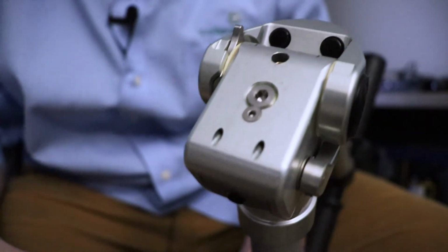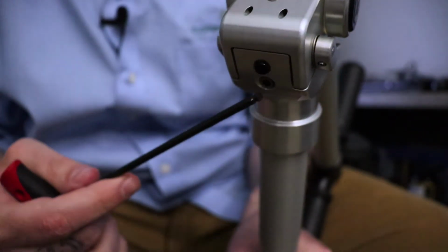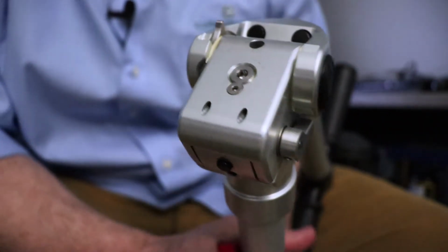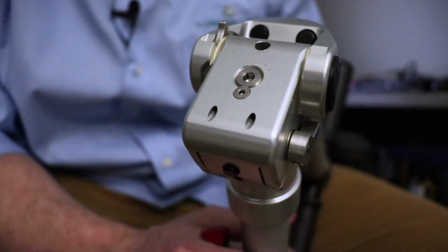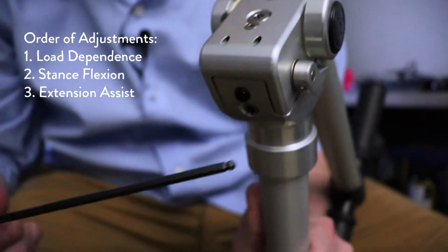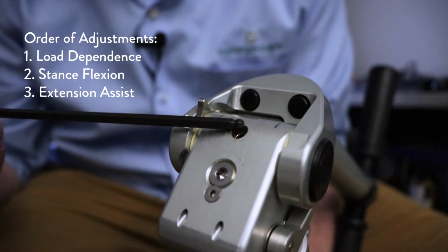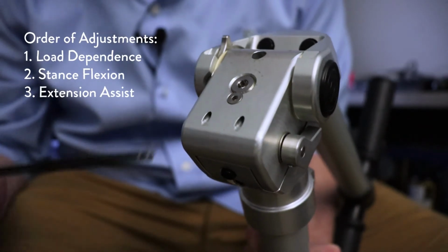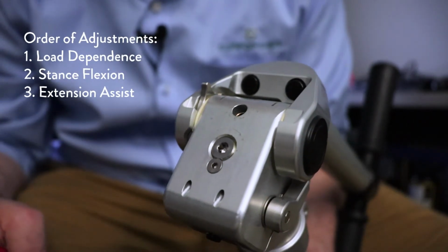Now if this still isn't sensitive enough, you need the brake more sensitive. That's when you move to the stance flexion and remove a little bit of that stance flexion. But like you saw before, too much can bind it up. So a little adjustment goes a long way. Once we have our load dependence where we want it, we adjust our stance flexion if necessary. That's when we would move then to extension assist. So that's our order of operations and adjustment: load dependence, stance flexion if necessary, and then extension assist.